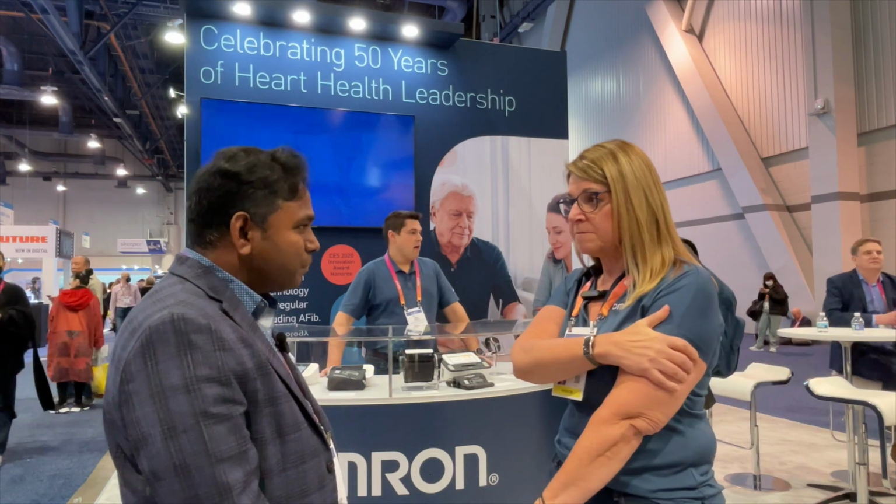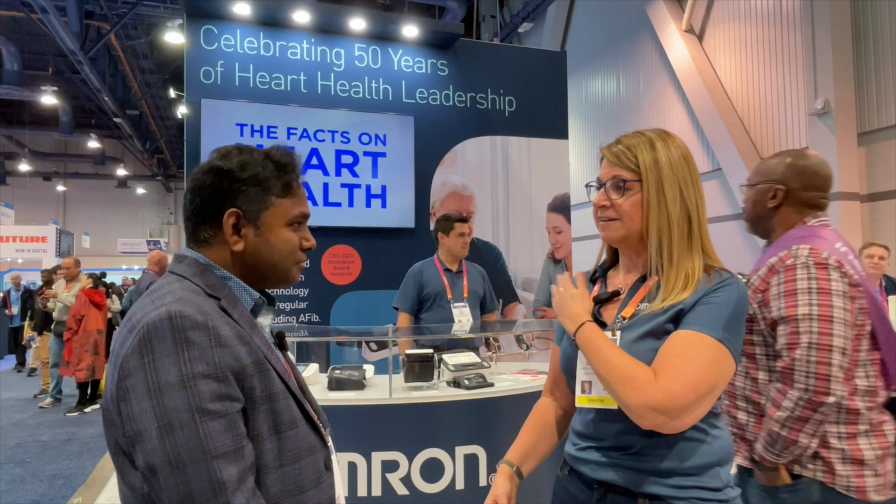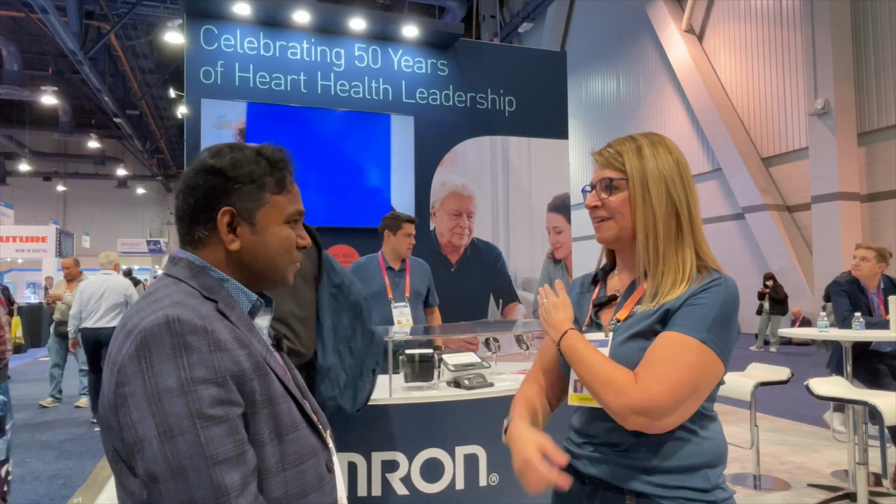So what kind of sensors do these watches have? Well, interestingly enough, it's a number of sensors that are proprietary to Omron. But the one that I think is most interesting is the one that tells you if you've got the device positioned correctly, because it's worn on your wrist. In order to get the most accurate blood pressure reading, you have to hold the device at heart level. So if you're using an upper arm device, the cuff is already at heart level. But on your wrist, if someone holds their arm down at their side or is moving and waving, you're going to get an inaccurate reading. So it reminds you to hold it at heart level, and it buzzes when it's in the right position because it's measuring the angle that your arm is at.